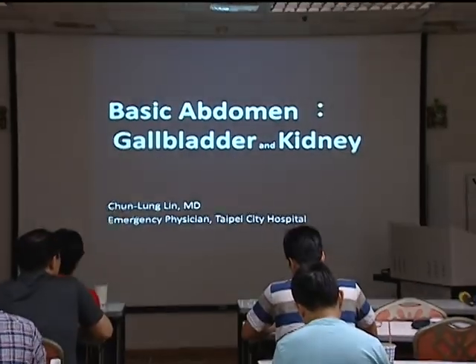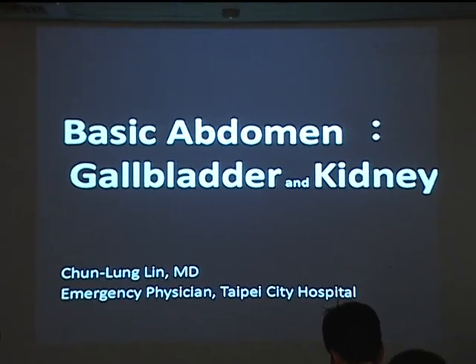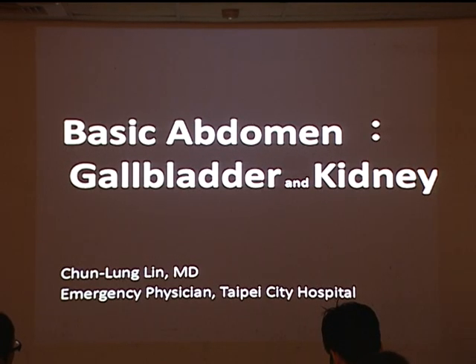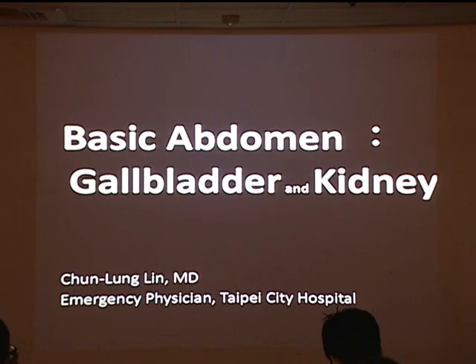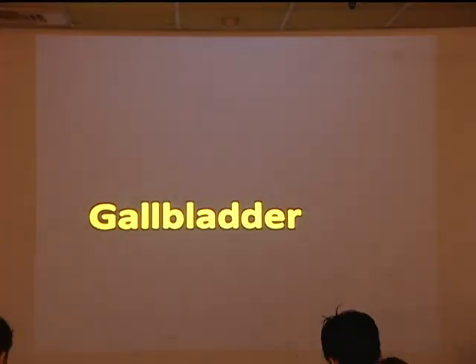Okay, and in this part, I'll share some experience of basic abdominal ultrasound in the gallbladder and kidney. This topic is actually a really big topic, so I'll try to finish this in 20 minutes. Okay, so I'll start from the gallbladder part.